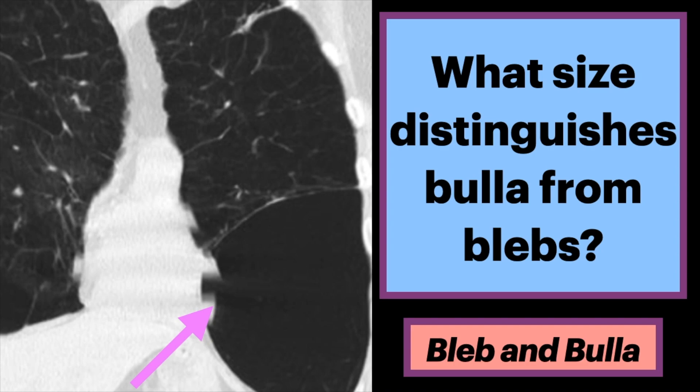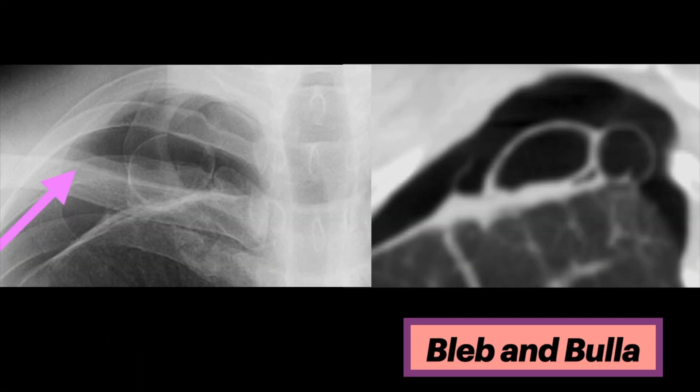What size distinguishes bullae from blebs? These images, including a frontal chest radiograph on the left and coronal chest CT on the right of a patient with a right spontaneous pneumothorax, show right apical bullae or blebs, typically found on imaging of affected patients.